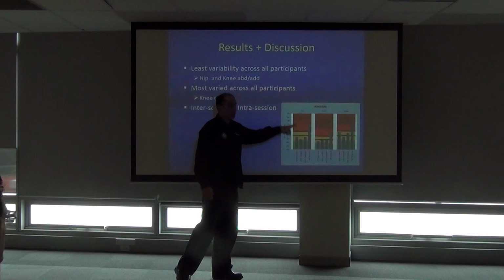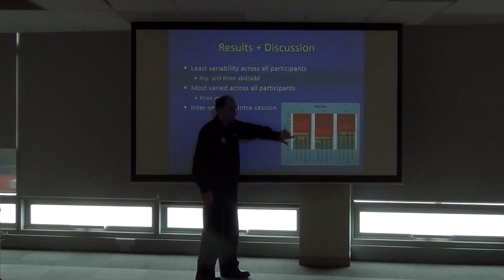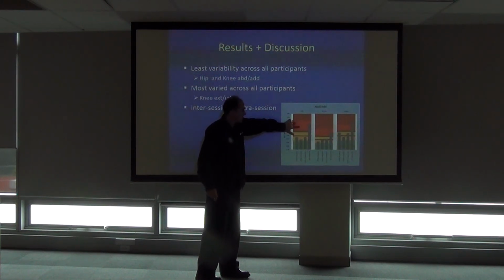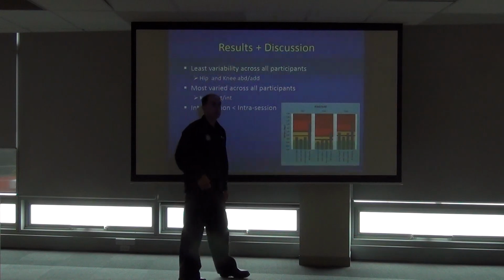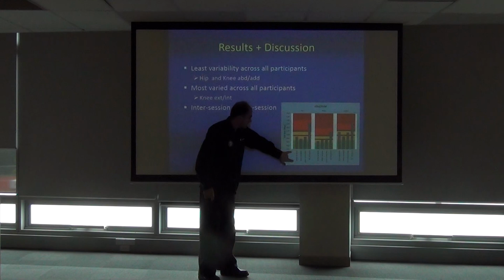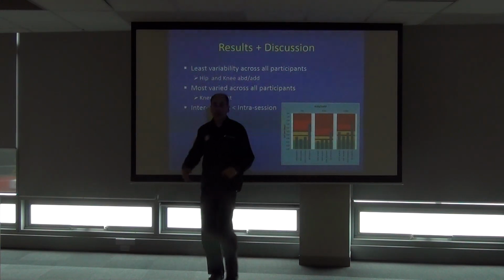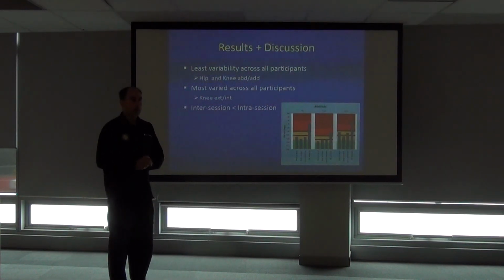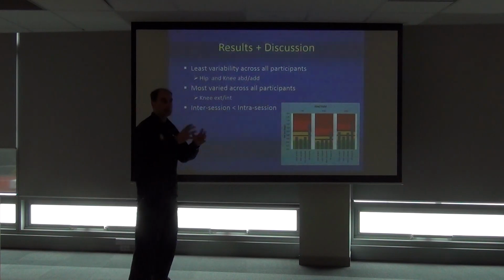Intra-session variability, besides being a lot smaller, is the usual reliability result in every other study. You go to inter-session and there's usually a big jump, poor reliability. Inter-subject, another big jump, poor reliability. This one, the only reliability study I've seen, intra-session, you go to inter-session and there is a consistent increase in reliability. You're more reliable for the same subject testing on different days than on the same day.